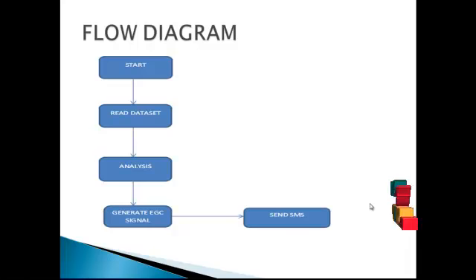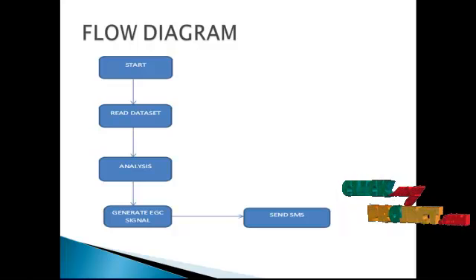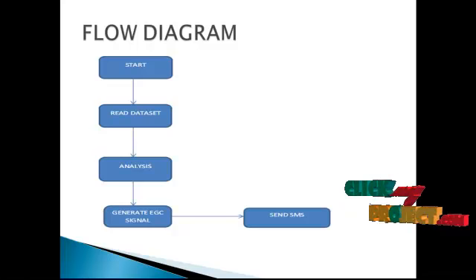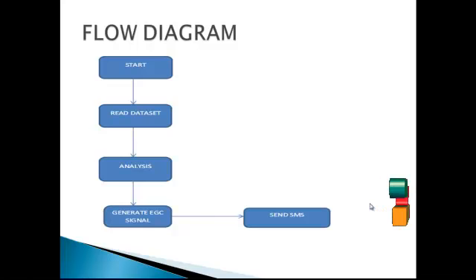Initially, this module is involved with setting up communication with the ECG device using the Android Bluetooth API. After getting the data from the device, the next module reads and displays the output from the ECG system. The smartphone reads the data from the dataset, and after analyzing the data, it displays it on the screen. The ECG packet will be decoded and plotted using Java.